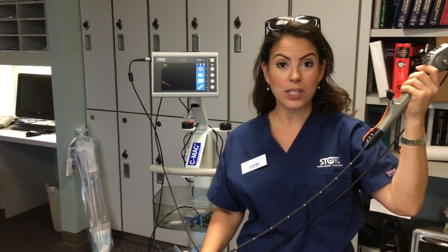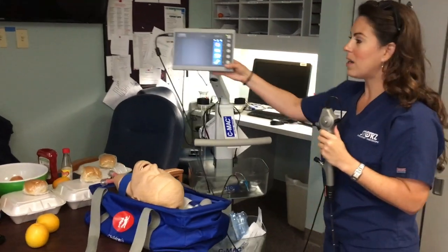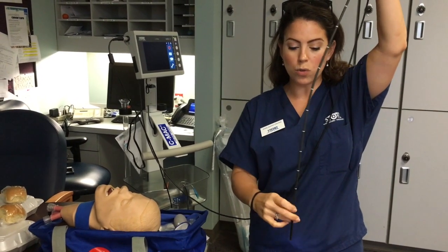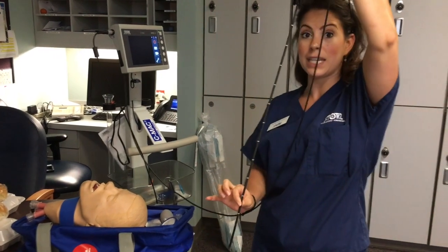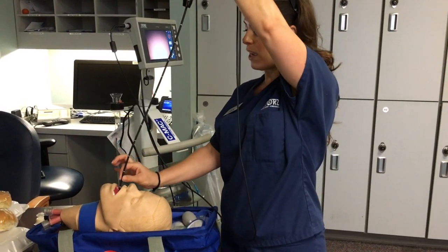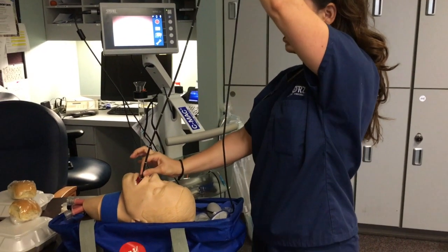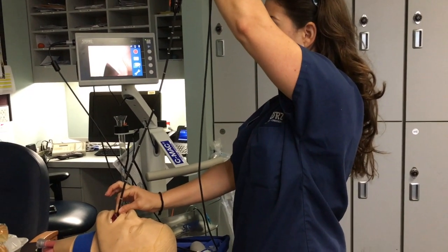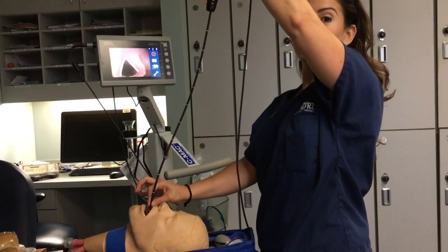To quickly visualize the vocal cords: swing the monitor as close to the patient as possible. Hold the scope between the first and second centimeter markings, keeping it nice and straight with no kinking. Rather than just threading the scope in, advance it until your fingers graze the lips, then deflect upward by pulling the lever down. That will give you an immediate view of the vocal cords, whether they are slightly left, right, up, or down.